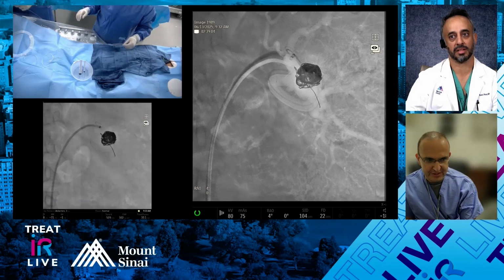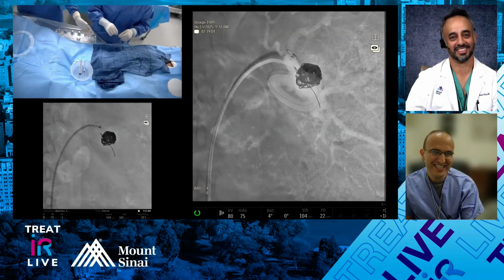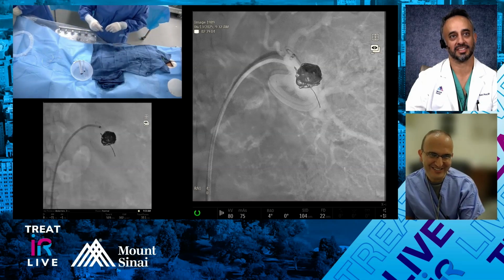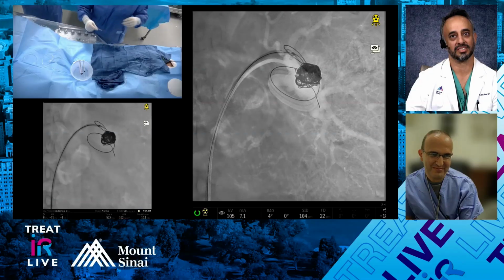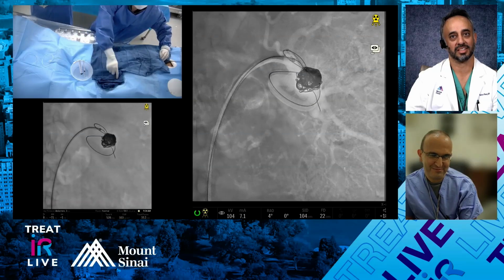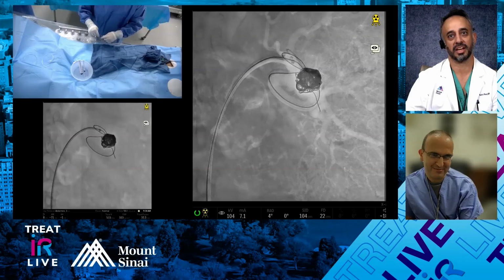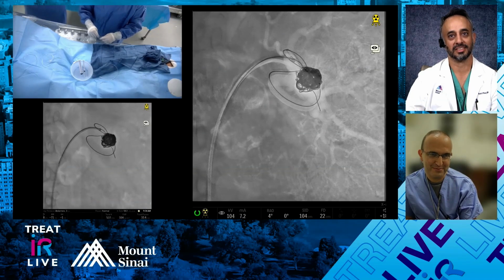Yeah, the push-pull coils are great until your last one, is a joke that I tell them. Exactly. I'm sure we've all felt that during training quite a bit, where you want to just get one more coil. It's all out of good intentions, but that last coil can really hurt you sometimes. I always say the first and the last coil are the two hardest to put in. Absolutely.